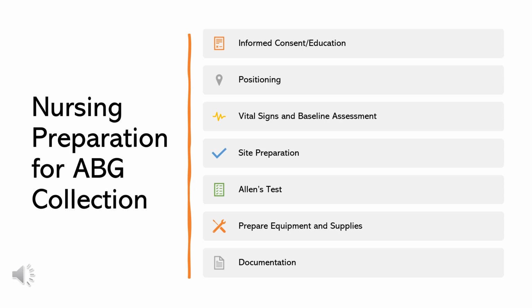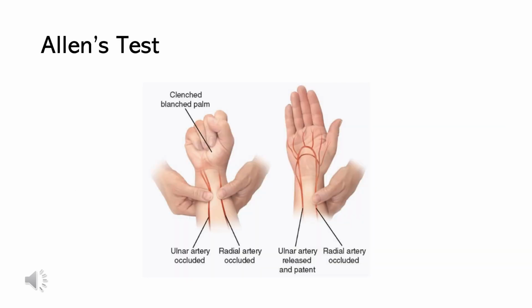Document. Make sure they confirm that all patient identification details are correctly placed on the specimen label by the healthcare provider, and prepare to annotate any complications or notable patient reactions during the procedure in the medical record. Let's pause for a minute to talk about Allen's test.